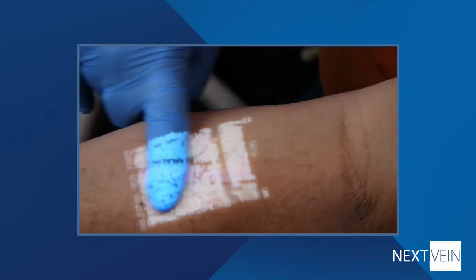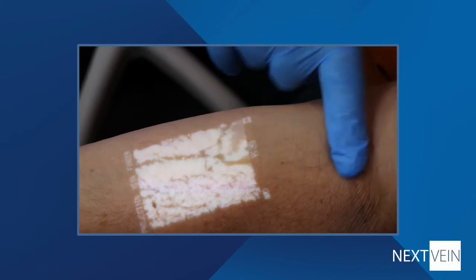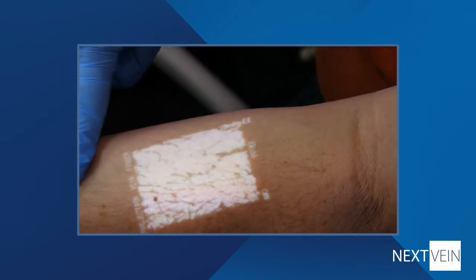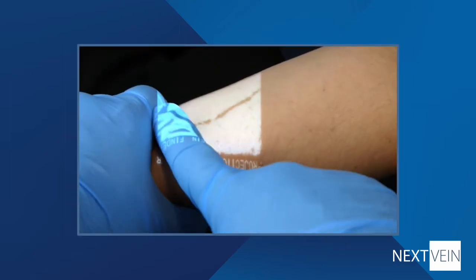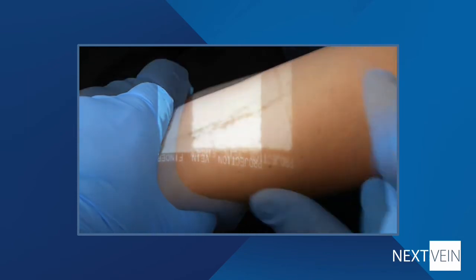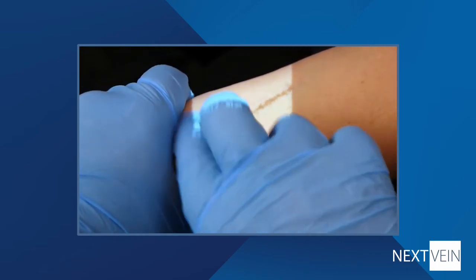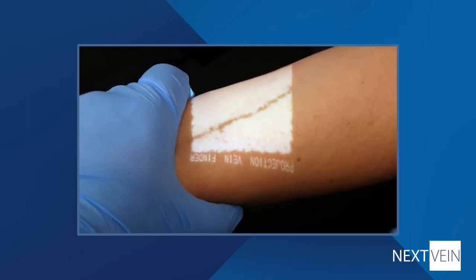There are two wipe techniques that you can use depending on the vein. The simpler technique uses one finger to wipe outward to empty the vein — press firmly when you're wiping. The vein will reappear after releasing the pressure. Sometimes the vein doesn't empty; this may be because the vein is filling from above. You can use a second finger above the wipe position to prevent that refill from happening, so you can successfully empty the vein. Releasing the pressure allows the refill, and you'll see the vein reappear.